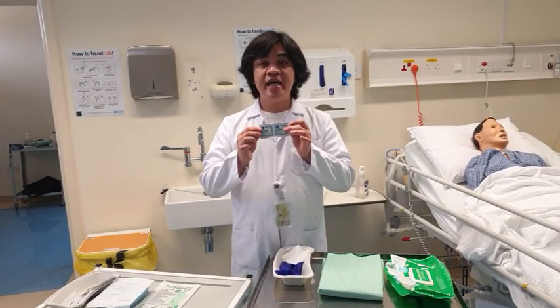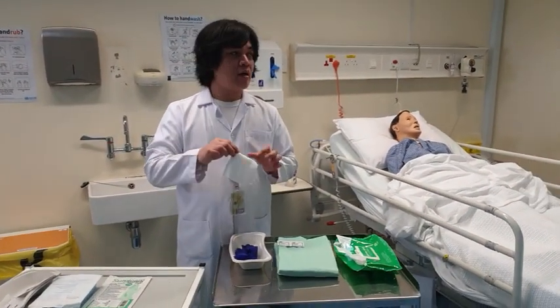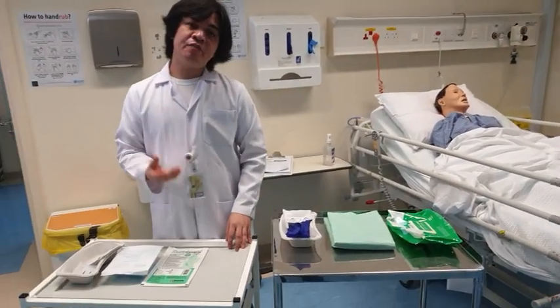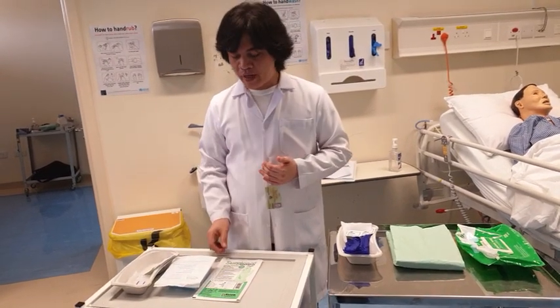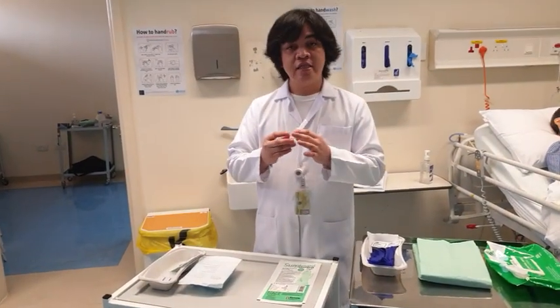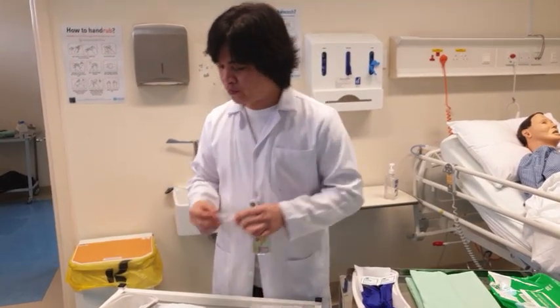We need to have adhesive remover. We're going to use this one to remove the old dressing of our patient. And of course, we need a pair of sterile gauze or 4x4 gauze. Clean gloves. Since this procedure is a sterile procedure and there is a risk for infection to the patient, we're going to use surgical gloves. What else? This is very important. This is the cleaning agent that we're going to use, normal saline solution. However, in some hospitals, they might have a different cleaning solution.